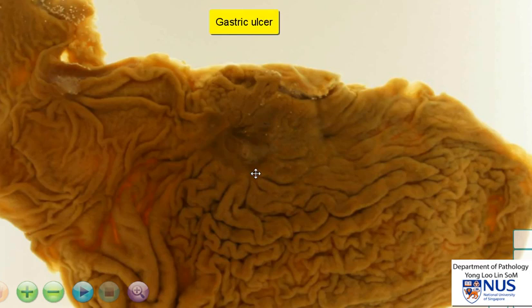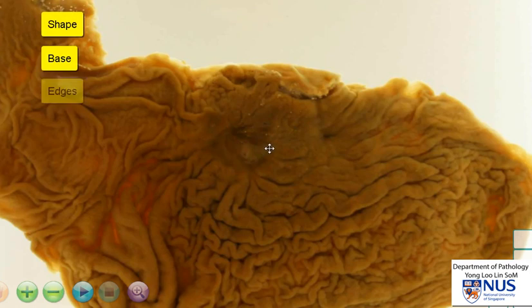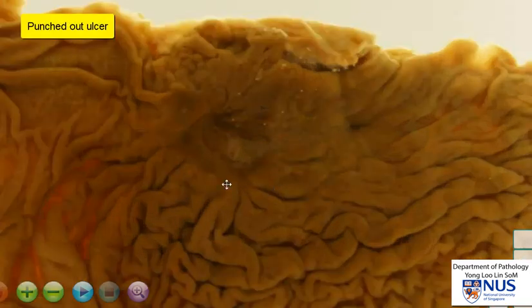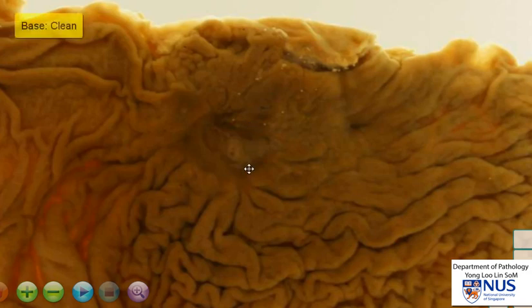When we look at gastric ulcers, we want to describe the shape of the ulcer, the base of the ulcer, and the edges. Looking at the shape, it is punched out. It has got quite a sharply demarcated outline and it's slightly irregular in some areas.